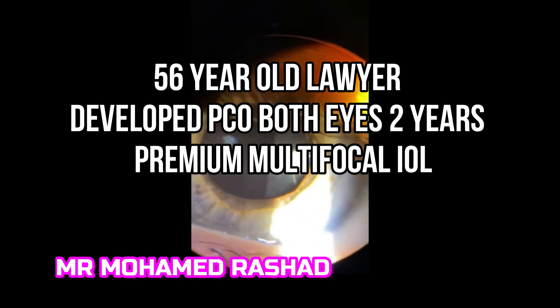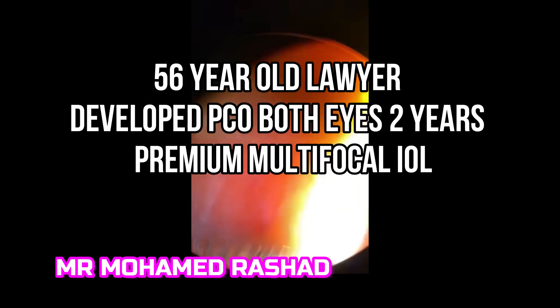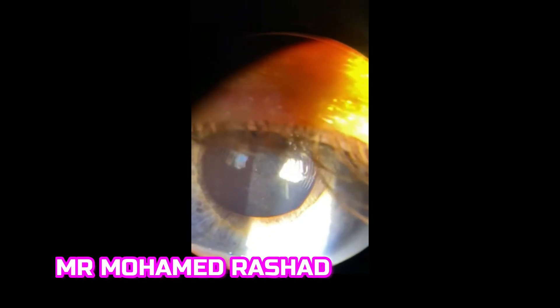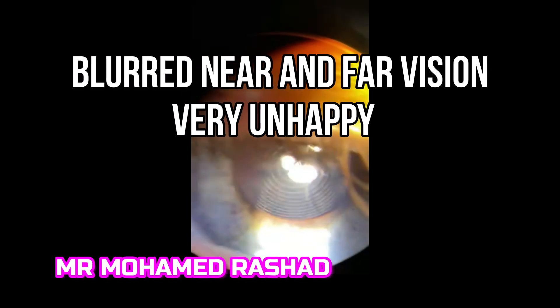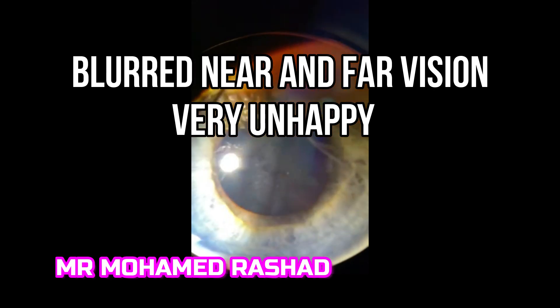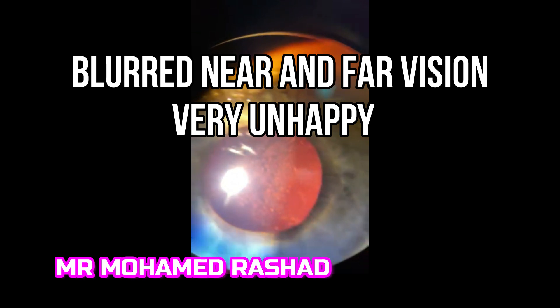This is a 56-year-old lawyer who developed posterior capsule opacification in both eyes two years after premium multifocal IOL insertion. He is having blurred vision in the near and far, and is very unhappy.